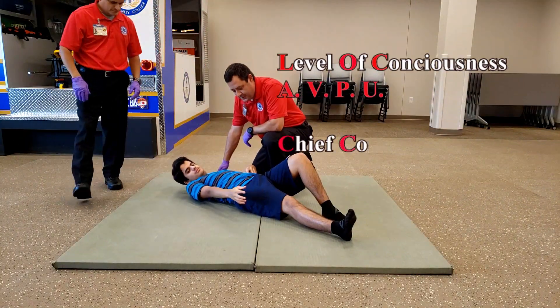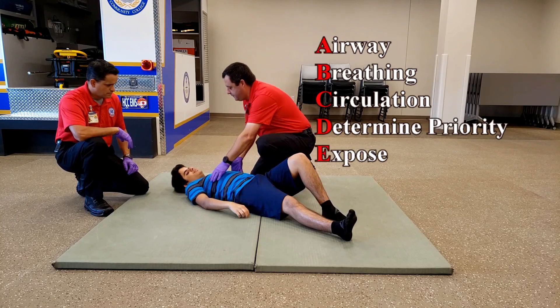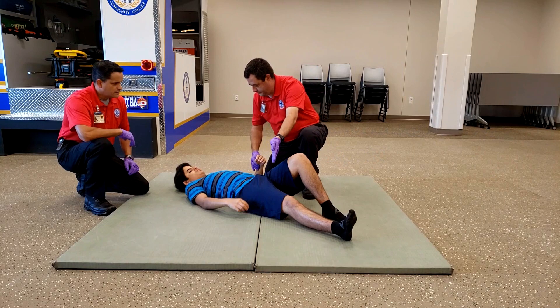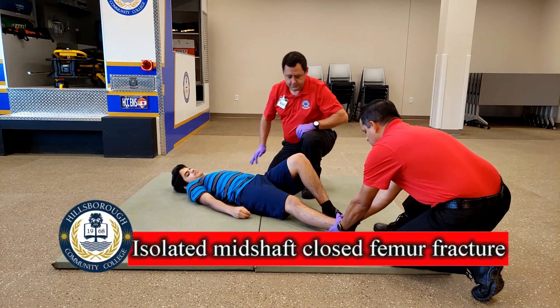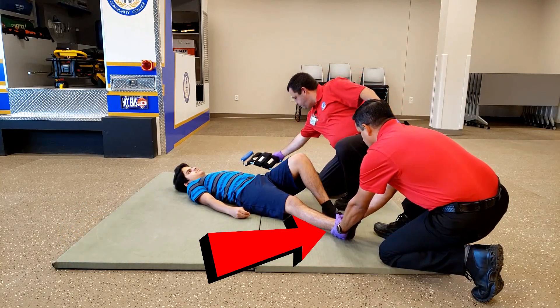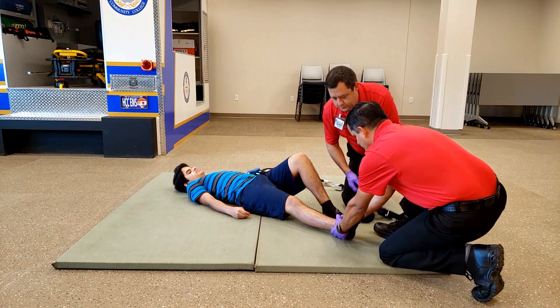Upon approach to your patient, gather their level of consciousness and chief complaint. Once finished with the primary assessment, perform a focused exam on the injury and verify that it is not only isolated but also mid-shaft on the femur and is a closed fracture. Have your crew member apply manual traction to the leg throughout the entire process until the splint is secured.